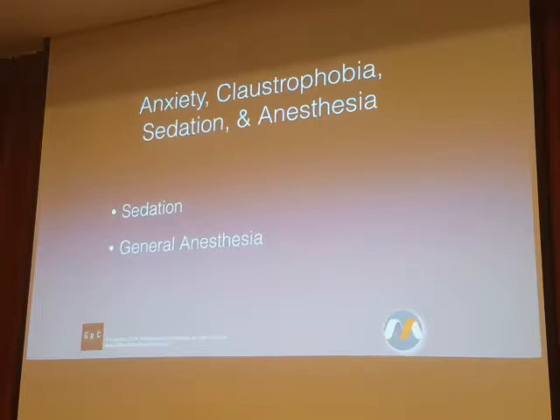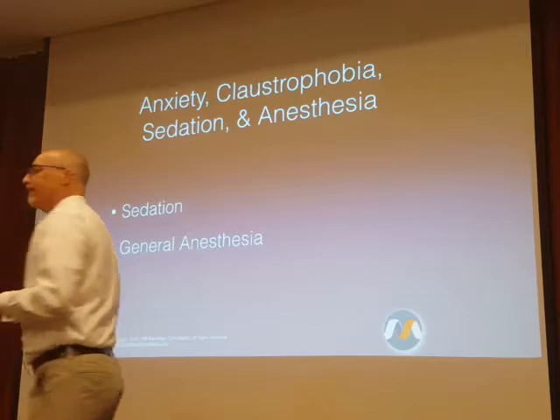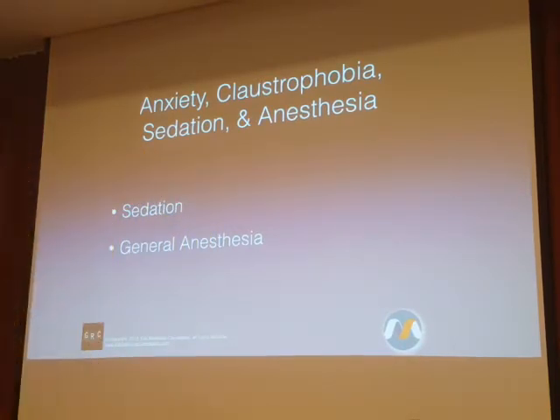Similarly, if they come to MR, they need to understand and appreciate that they are playing by the rules of MR. And in fairness to both you and to anesthesia, there should be a very bright line that defines that boundary: that MR will not say or do anything that will directly get between that anesthesiologist and the care of that patient from a clinical standpoint.